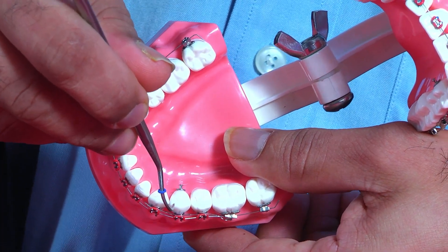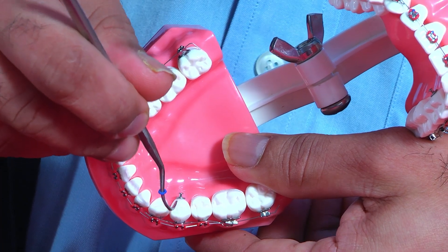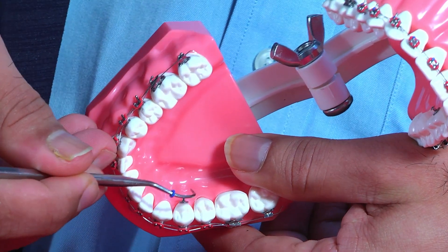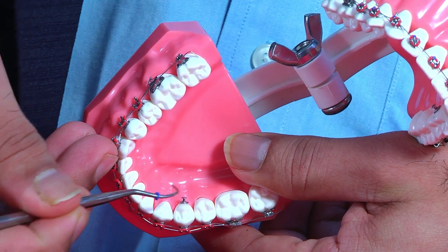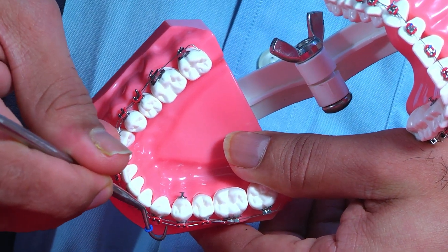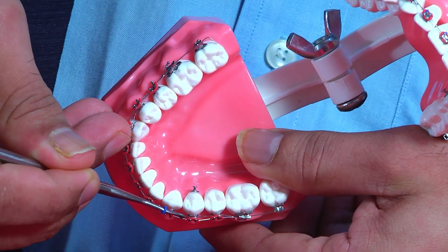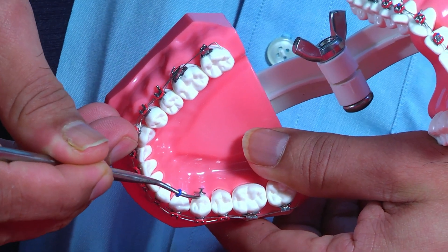To correct the mesiolingual rotation, for example, you would need a force pulling this towards the mesial. So you need a force to come from here — from the archwire, because that is where you have the force — onto the lingual button.